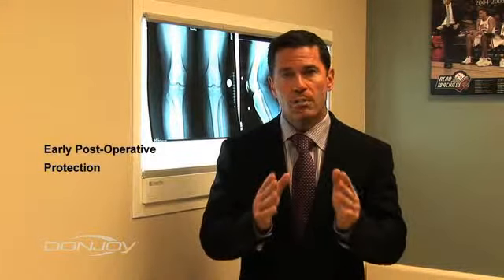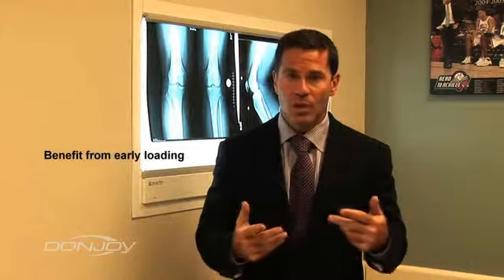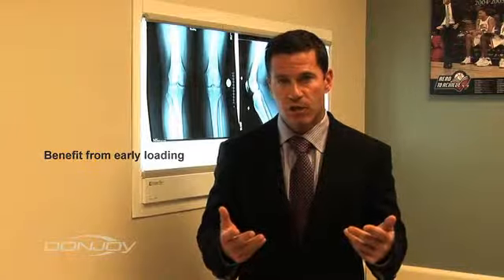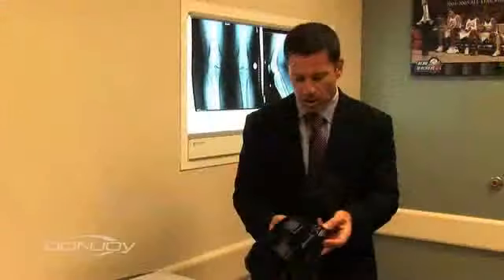They require an early postoperative period of protection, but they would all benefit from early loading based upon the biophysiology of that healing environment. To many of you, this brace may look very familiar. It's a standard TROM brace, but it has that added functionality of the ability to unload.